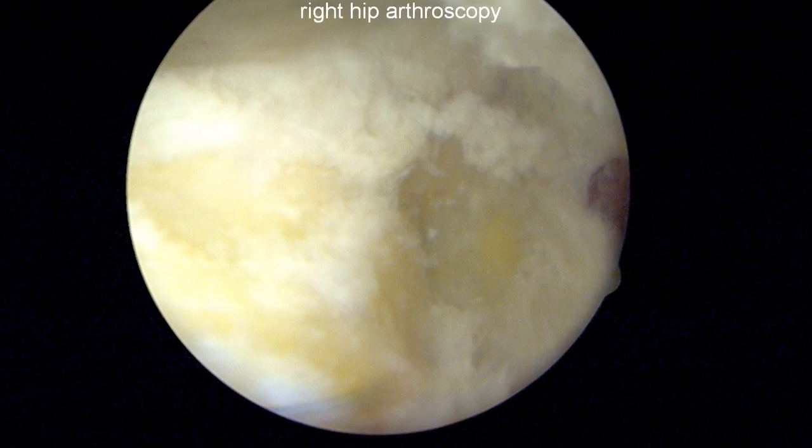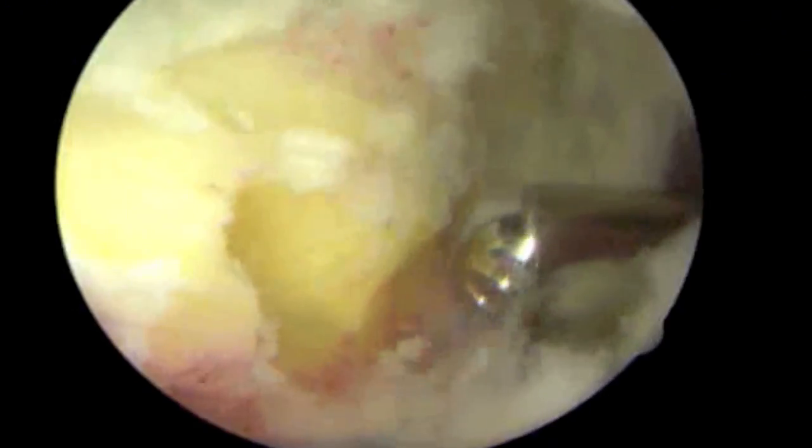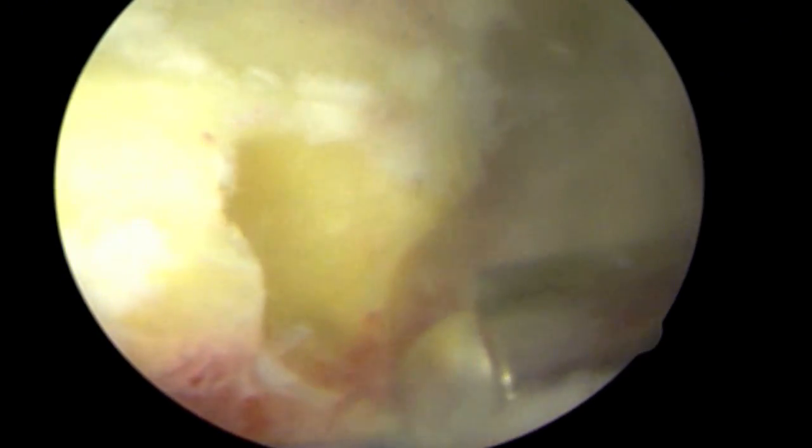Once the fragment has been removed, you can see a defect here, which is then smoothed out by performing a rim trimming.